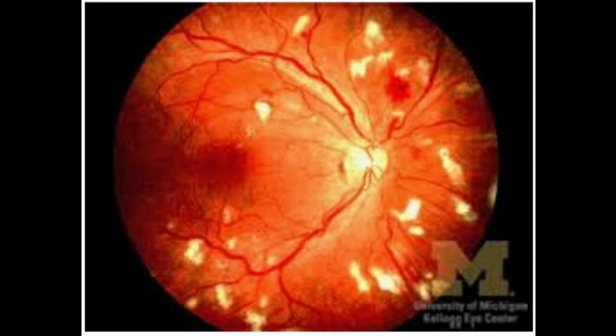So here is another common eye abnormality that you may see. And this is cotton wool spots, another image from the University of Michigan. Cotton wool spots are secondary to diabetes. Also, hypertension can cause this, but it's most commonly caused by diabetes. And you can see it looks just as the name sounds, cotton wool spots. So those white patchy areas that look like cotton are the actual spots. And these are easy to identify when you start to see them. And this is a severe case, I should say, but you'll be able to notice it. And what happens is those nerve fibers are damaged and they begin to swell, and that's how they look after the damage has occurred.